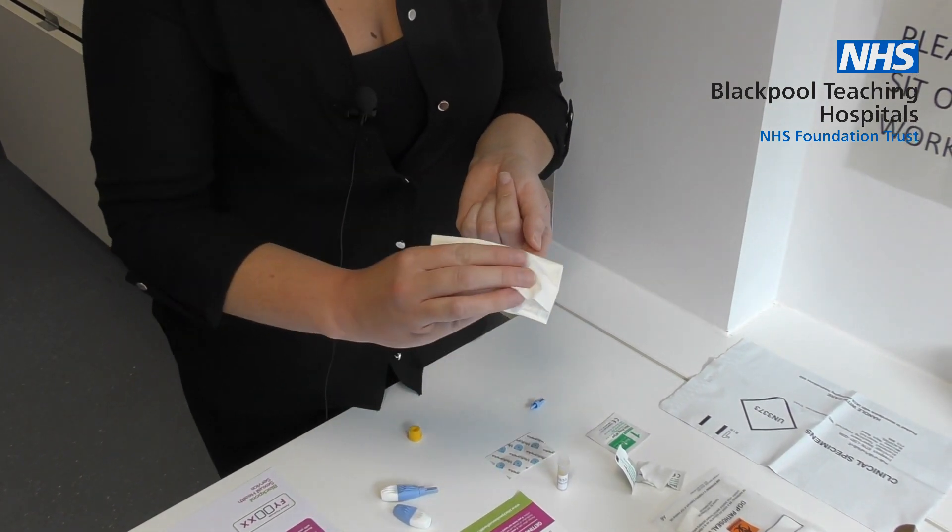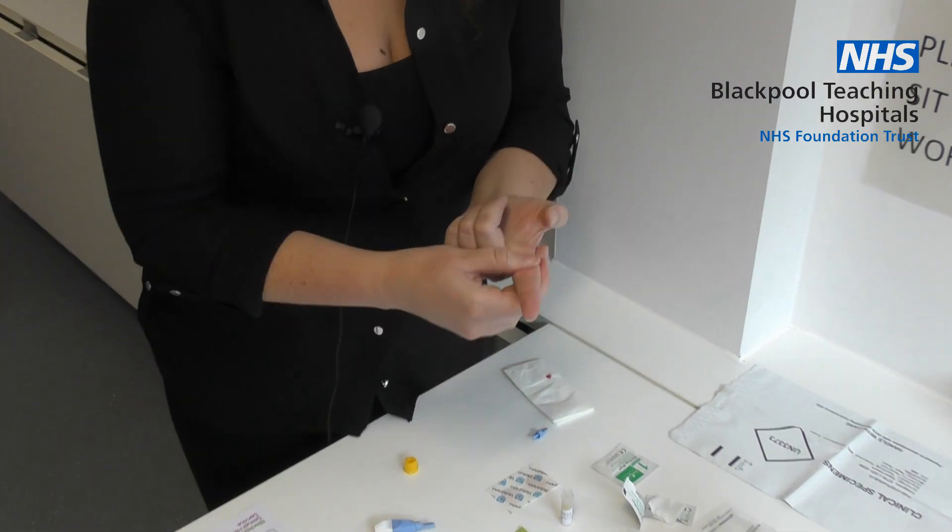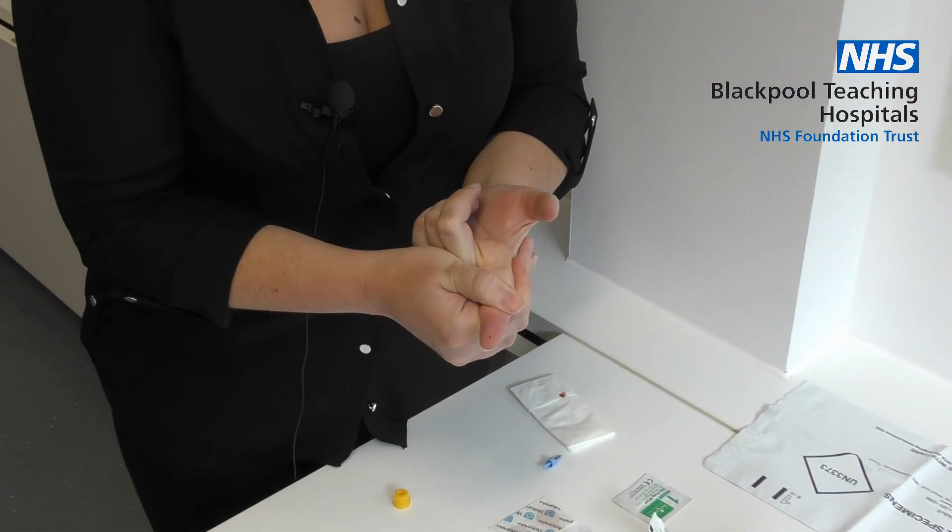Wipe away the first drop of blood with a clean tissue. Then gently massage the finger from the knuckle to the tip.